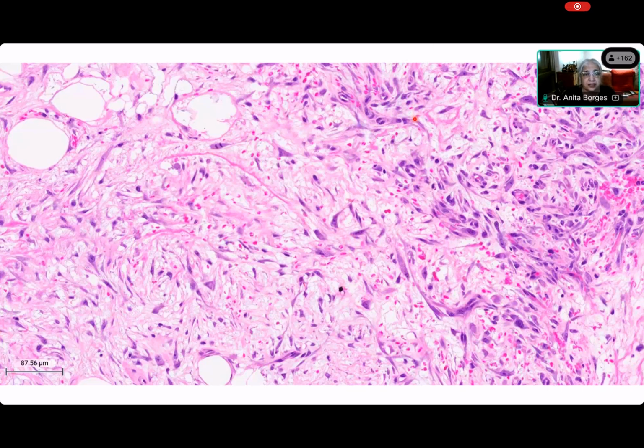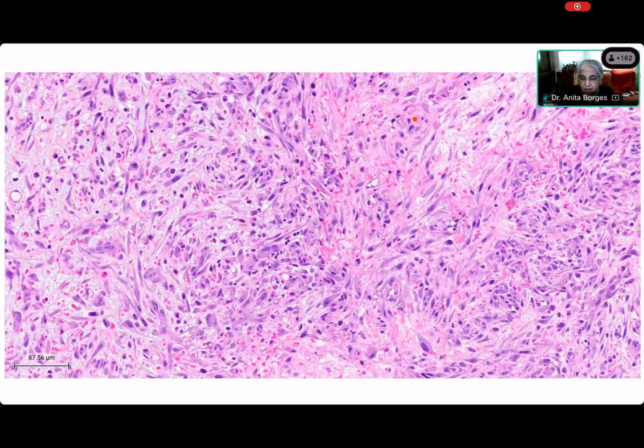So what is a stellate cell? Look at them. They're all over the place. So what do you think is the stellate cell, Elsa? What is the stellate cell? Fibroblast? What is it, Elsa? Myofibroblast. Myofibroblast. Because if they were fibroblasts, they would look like the cells over there at the top. Can you see? Yes. So these are fibroblasts. Okay. But all of these stellate cells are myofibroblasts.